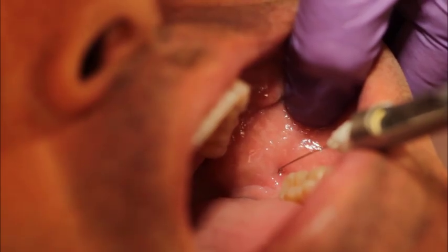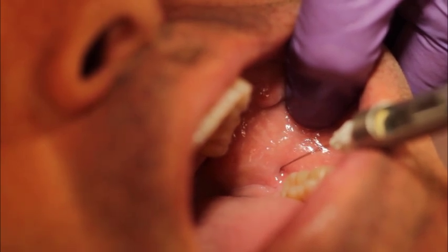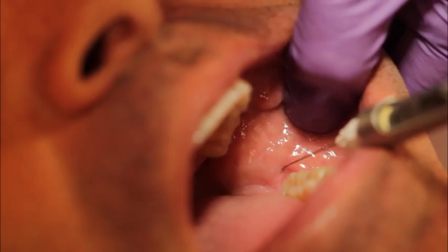Insert the needle into the alveolar mucosal tissue, distal and buccal to the most distal mandibular molar in the quadrant until you gently contact bone at a depth of 1 to 4 millimeters. Pushing the softer tissue of the buccal fat pad over the injection site after initially retracting the outer cheek may make the needle entry more comfortable for the patient.